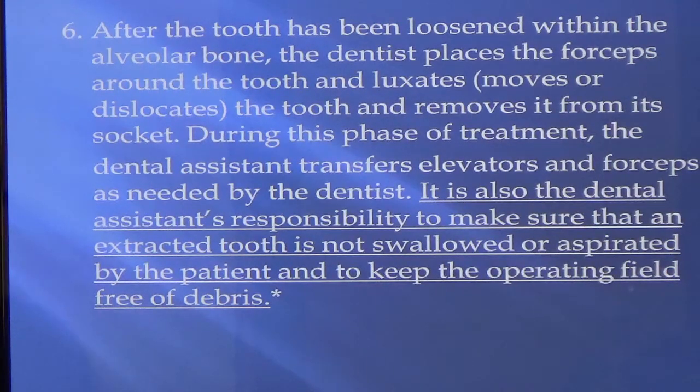So there's different types of elevators, and you normally start with a small, medium, and a large. So the first elevator you'll be small, then he'll ask you for another one, which is the medium, and then the third one is the large. They just vary in the width of it.